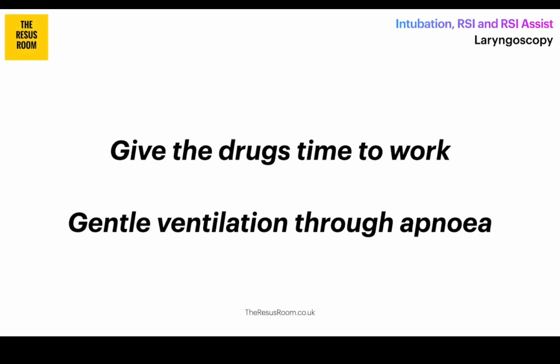We've been through the pharmacology now, and we know that the paralytic is going to help us get the best view, relax those cords, relax the muscles around the airway, and we need to make sure that we actually wait long enough for them to work and don't rush to get the tube in. And conventionally, that's around 60 seconds for rocuronium, and then you're going to check that the jaw is relaxed.